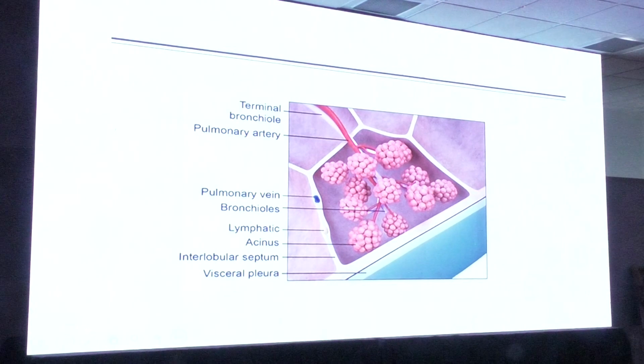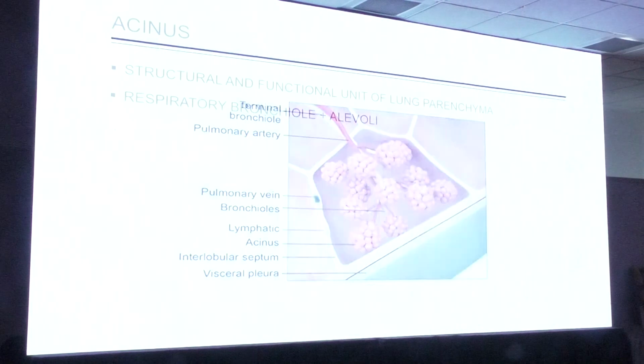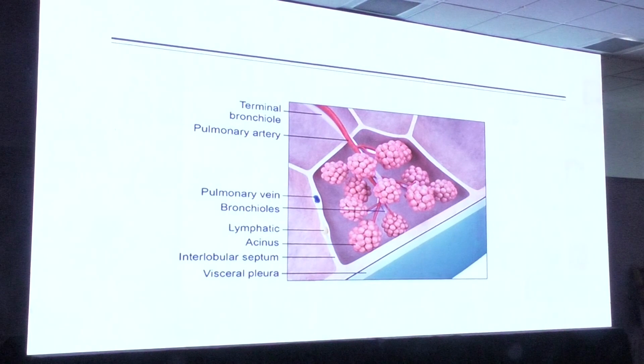This diagram you might see in the next 5 slides continuously, so just look into this very carefully. Here you could see a hexagonal structure, which is a secondary lobule. This is a primary unit of the lung, which you should know, because all your interstitial patterns or HRCT patterns will depend on a secondary lobule. The secondary lobule is hexagonal in shape.